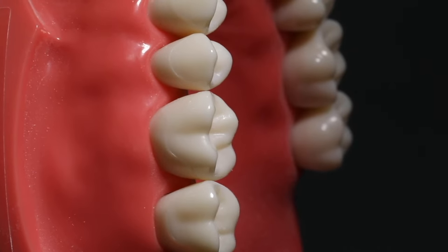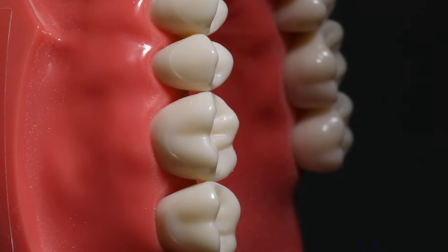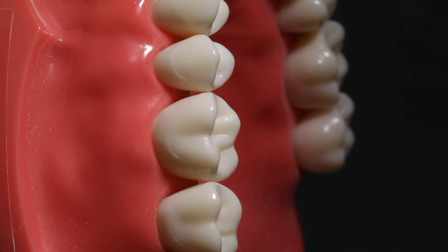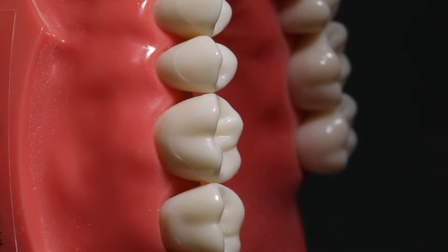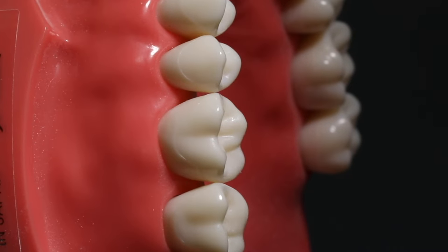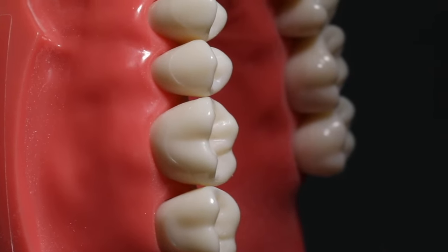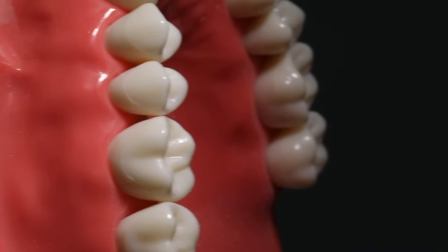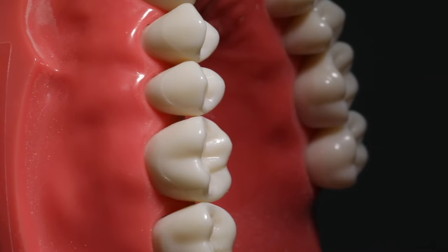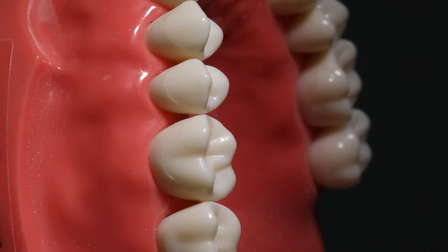So when it comes time to do our axial reduction, rather than using the 6878K018 diamond, we will use a 5856016 diamond. It's the rounded end torpedo shape. So we'll start with our 1557 crosscut fissure burr rounded end to do our guide cuts and our occlusal reduction and go from there.